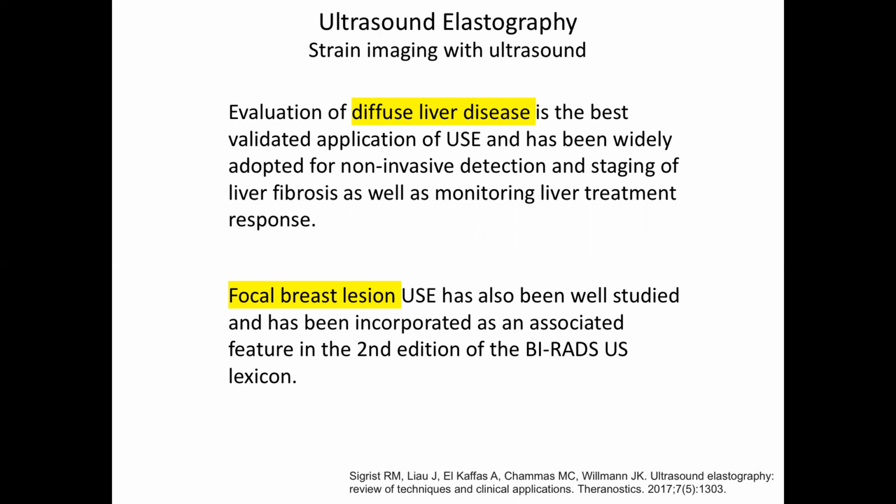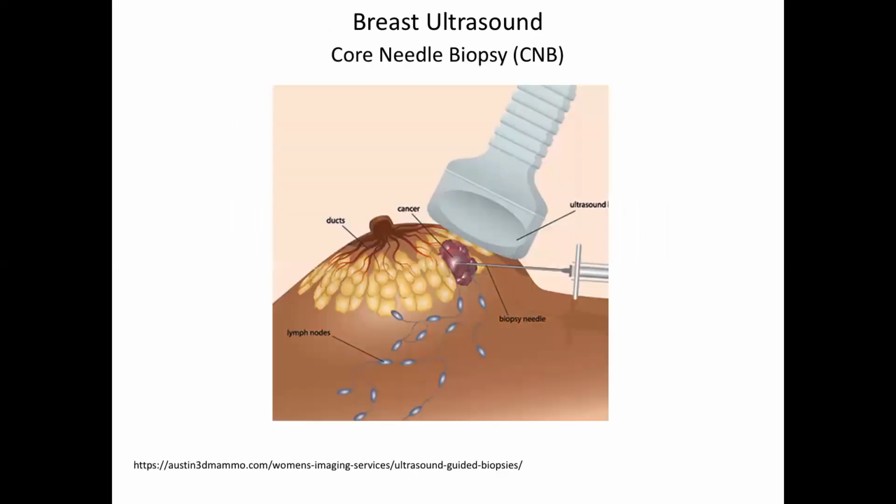And because when you're a surgeon and you're looking at the tissue, it looks the same, right? Visually, it just looks the same. It's not like a blue thing is the cancer. And so you have to know, like, what should I cut out? And so you can mark it. So we can go to that application now.